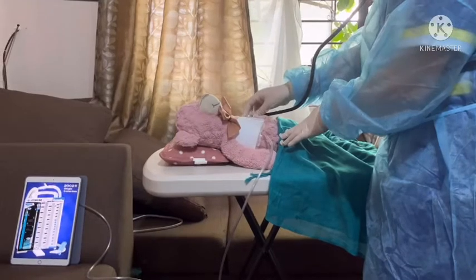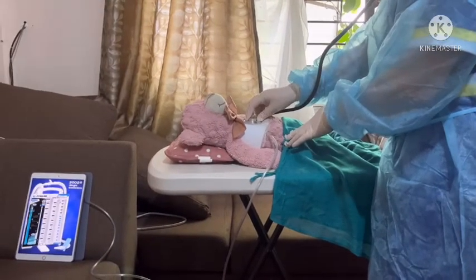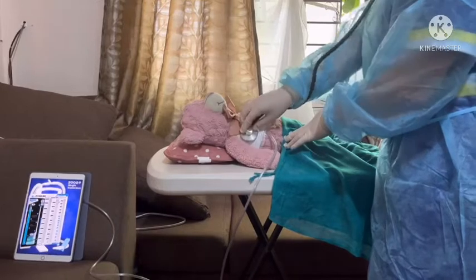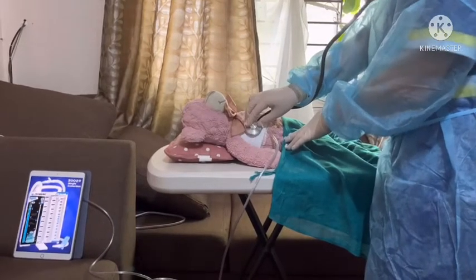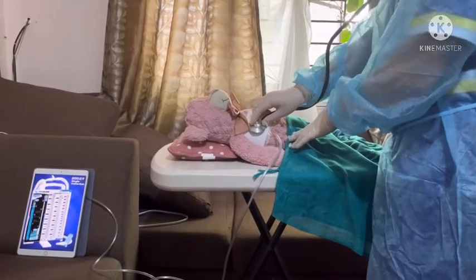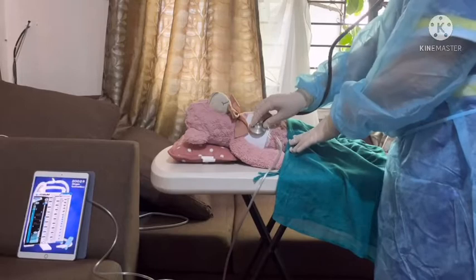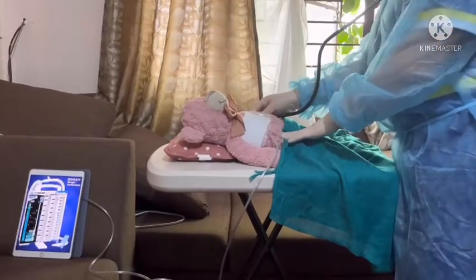So we can hear some diminished sounds, which is expected because of the chest tube.